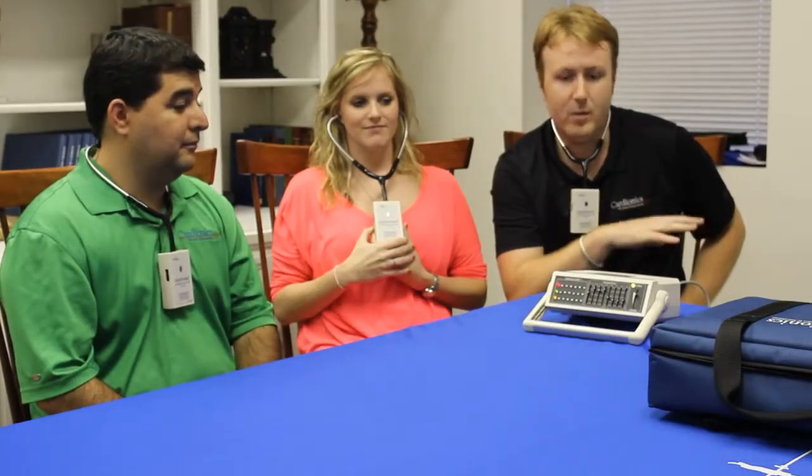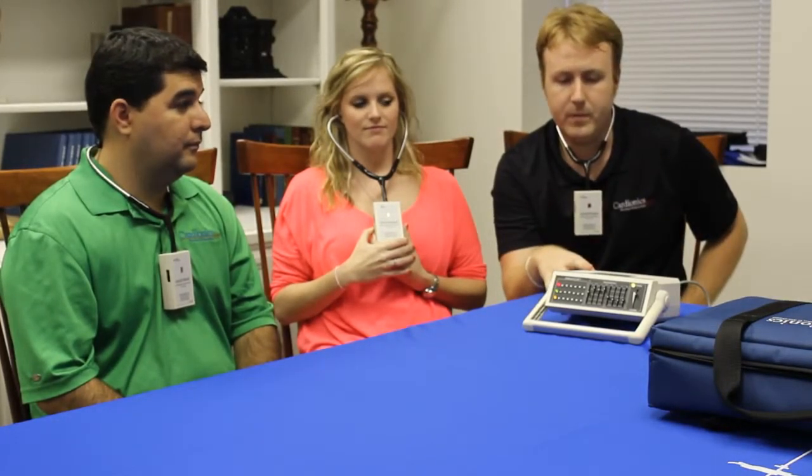This is a scope that can be used in clinical situations, in teaching situations, as well as in telemedicine situations. It's probably one of the more well-rounded products that we have and really fits into each one of our product categories. Thank you.